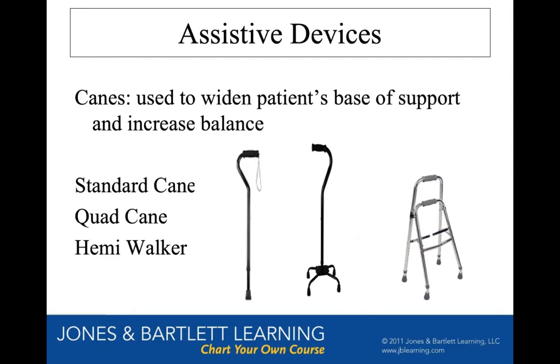We used to do a lot of our gait training with long dowel rods that were literally 6 foot long wooden dowel rods from Home Depot. They were just makeshift walking sticks. We would put duct tape around them to be the hand grip, and that's what we did our gait training with.